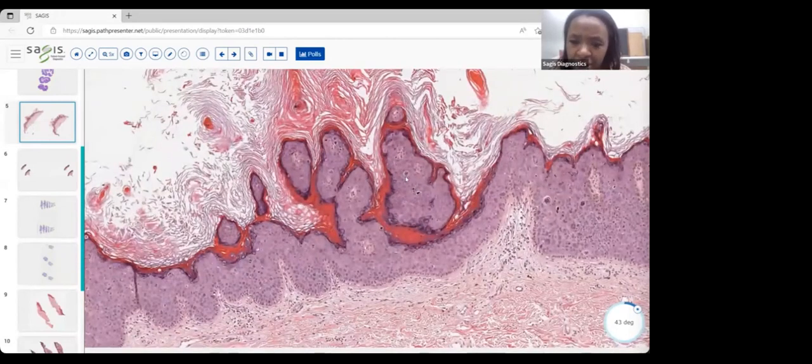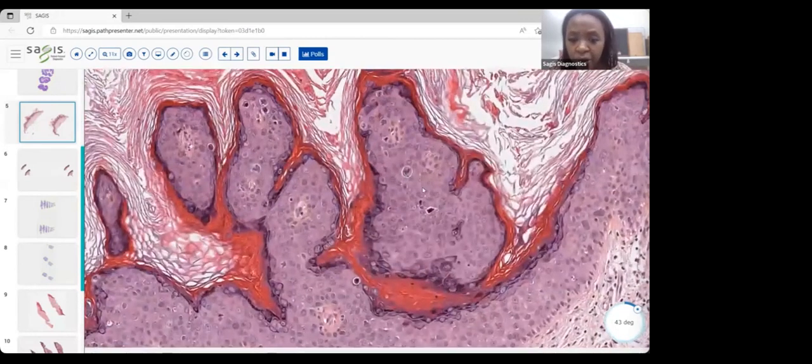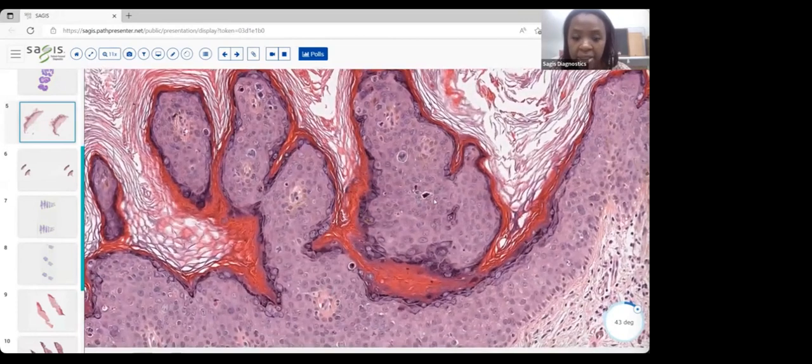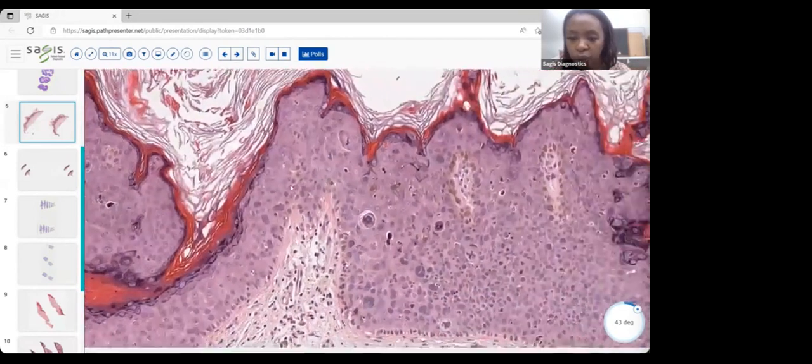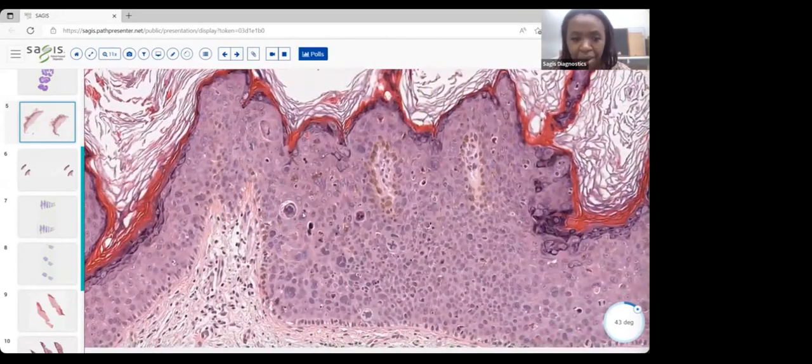But when we look closer, some of these cells really look quite altered. First of all, we're seeing many more cells that, yes, they have some clearing around them. There's a bit of a halo, but they're actually more eosinophilic, right? There's a dark red purple quality to them. So there are lots more of those. So these are actually apoptotic cells, right? There's dyskeratosis going on here. And then we are seeing mitoses, mitosis after mitosis after mitosis. There's a lot of mitotic activity here.